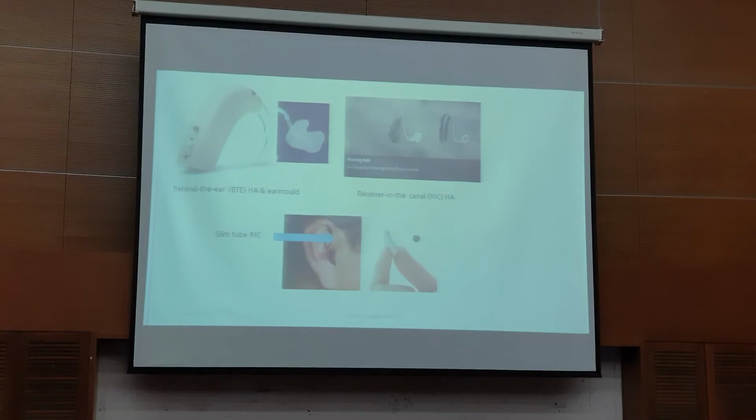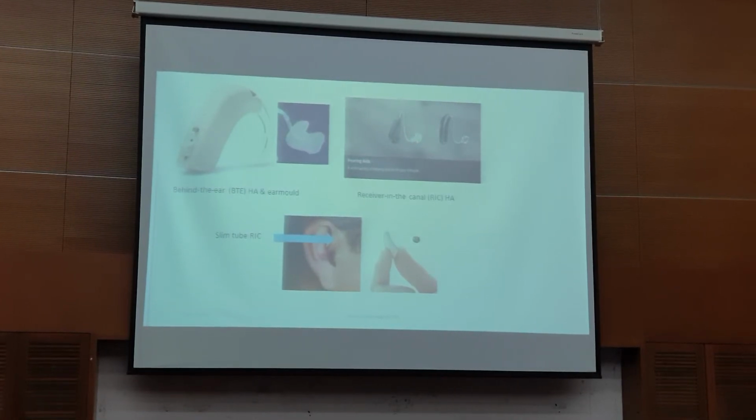We don't want that to happen. Kalau macam tu, you tengok balik dia pakai tu betul ke tidak, earmoldnya masuk ke tidak, ataupun earmold dia loose ke, ataupun earmoldnya buat tak betul ke, ada crack ke anywhere, macam mana bunyi boleh keluar. It shouldn't be.